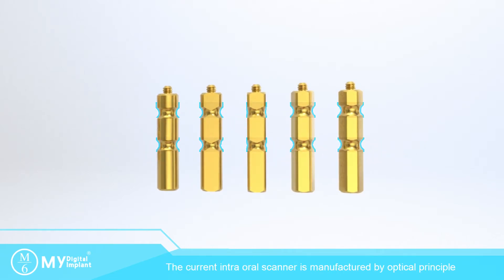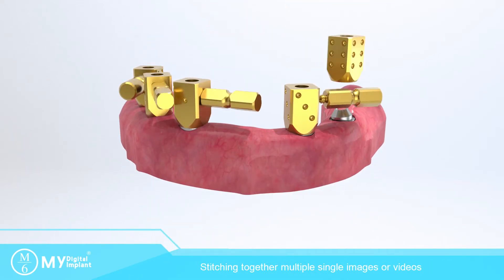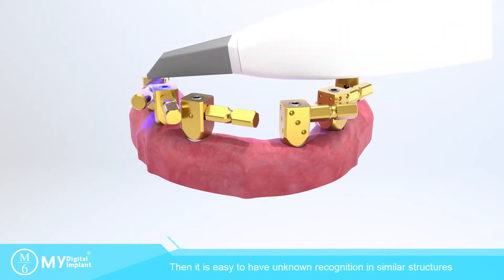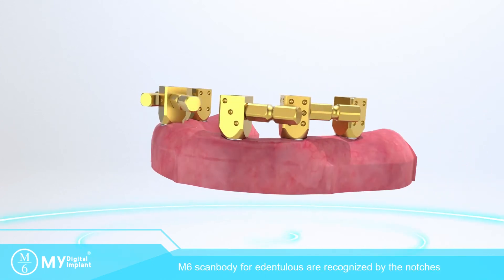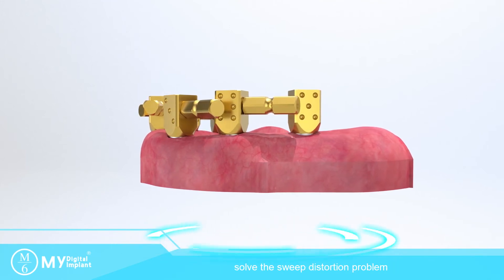The current intra-oral scanner is manufactured by optical principle, stitching together multiple single images or videos, then synthesized by computer. This makes it easy to have unknown recognition errors in similar structures and cause mouth sweep distortion. M6 scanbody for edentulous is recognized by the notches, solving the sweep distortion problem.